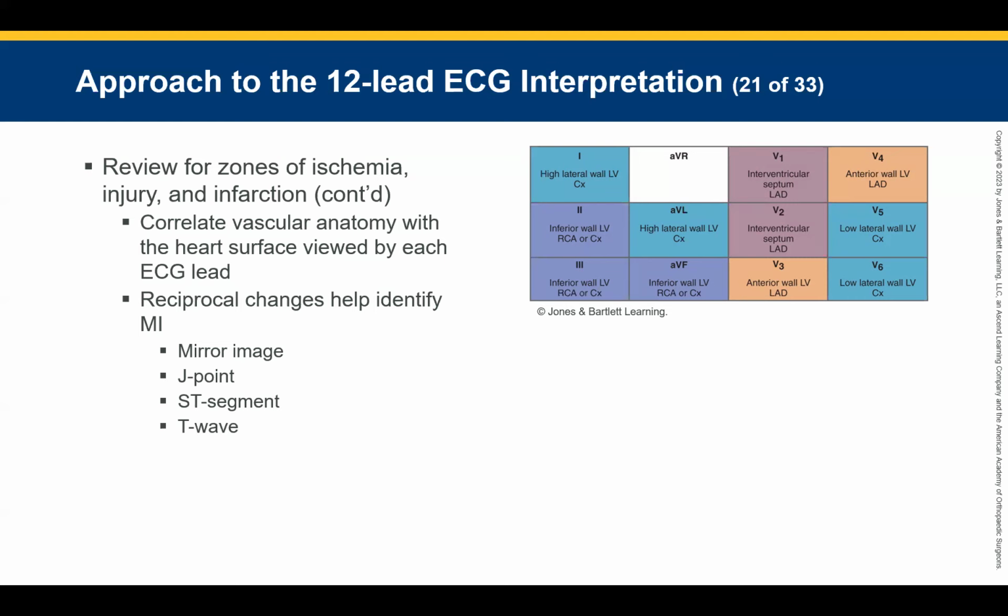So what view is the septal? Septal view, you look at the center wall. Got it. Okay. Then you have V6, 1. They're both lateral. High lateral, low lateral. Yes, we just haven't drawn that line. So I normally do something like this. It just gets confusing. Okay. Could you? Yes. You need to really be paying attention to your other laterals, your V5 and your AVL. I need to be looking for those reciprocal changes.